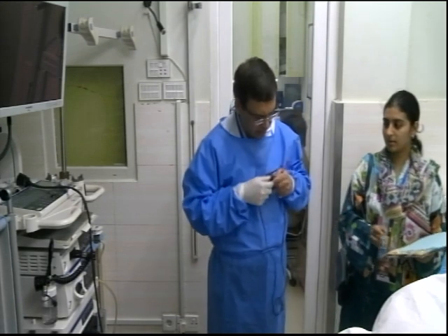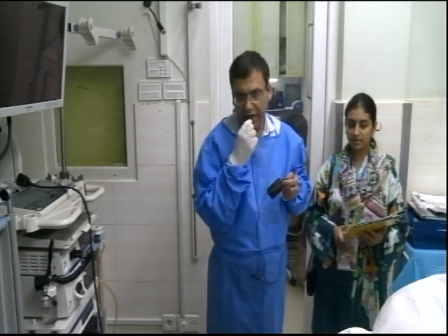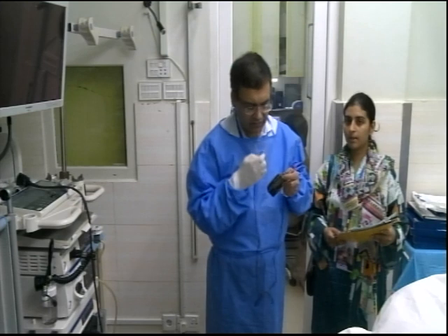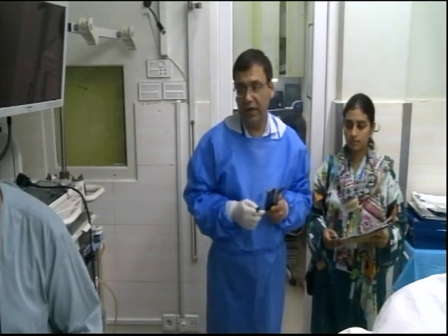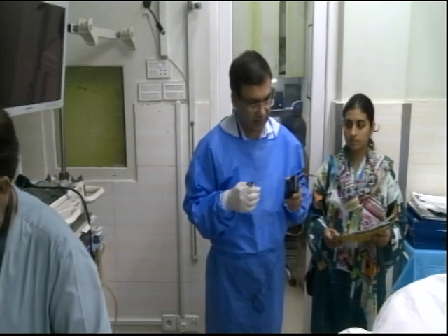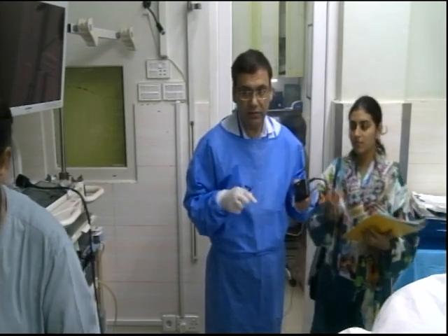Can see you, and we are all ready to see how you do EUS. Ready? Yes, I can hear you loud and clear, and we can see you. So this is a rectal EUS, I was told. Go ahead, tell us.